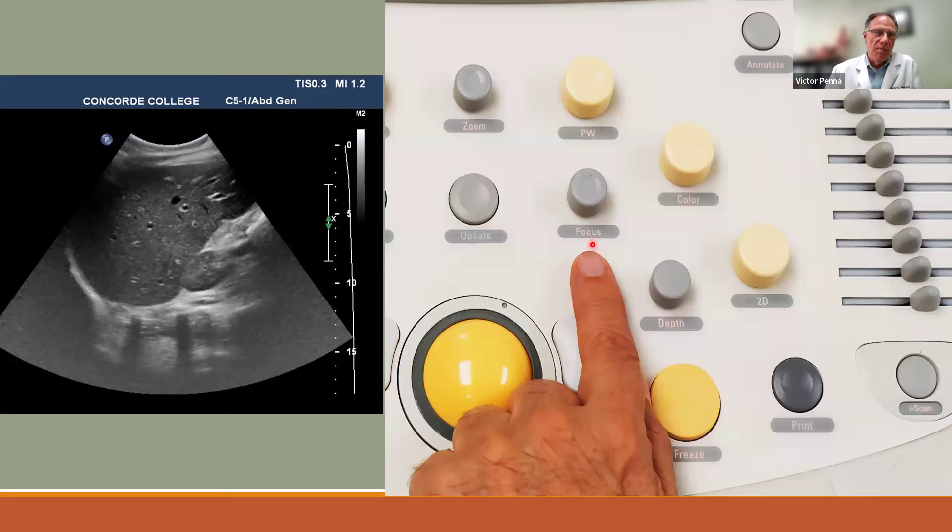Focus determines where the machine concentrates its lateral resolution — the ability to distinguish two structures side by side. Place the focal point at your area of interest. For example, if examining a polyp in the gallbladder, move the focal point right to the polyp for maximum detail. You can move it up and down. Some machines offer multiple focal points, but one focal point is generally preferred.